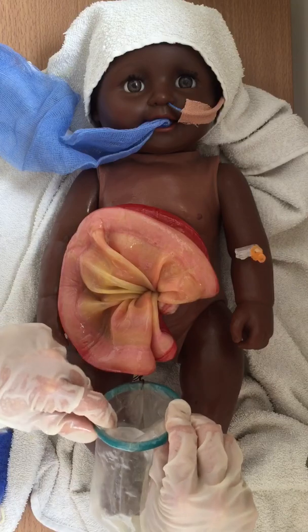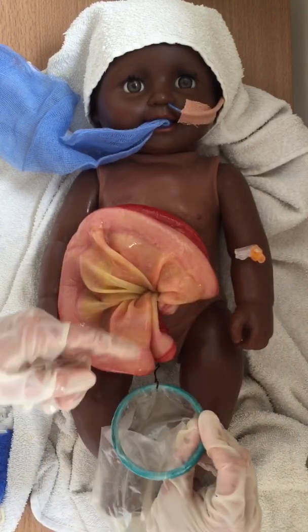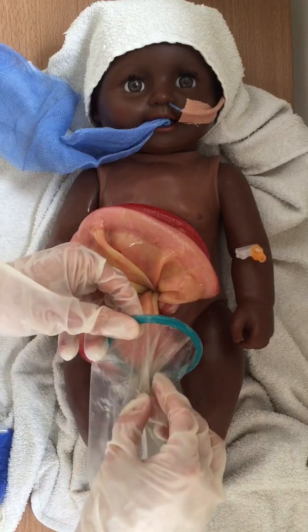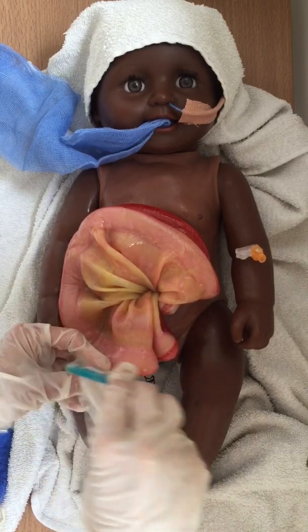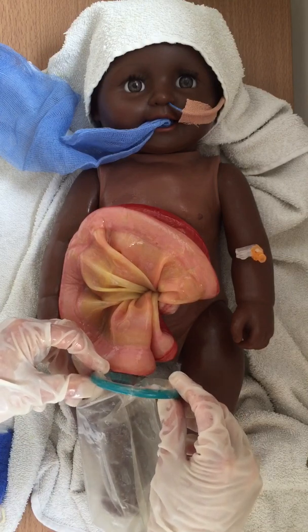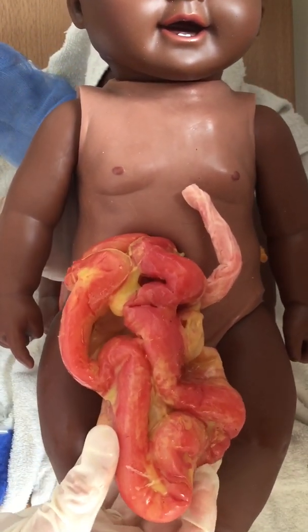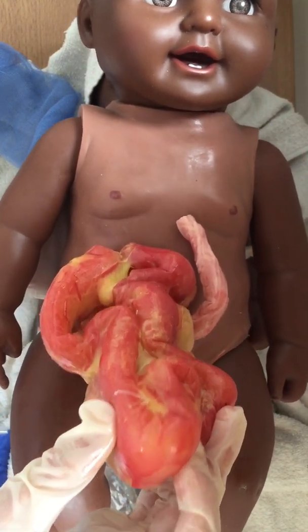I'm going to imagine the baby as a clock face: 12 o'clock, 6 o'clock, 3 o'clock, 9 o'clock. I want the cord to remain at 6 o'clock throughout the silo application and the seam at the top to remain at 12 o'clock without any twisting, as that can twist the bowel inside which can cut off the blood supply resulting in bowel necrosis. I also want to feed in the apex of the bowel first — on this baby with matted bowel, the apex is the top part of the bowel which goes into the silo first.